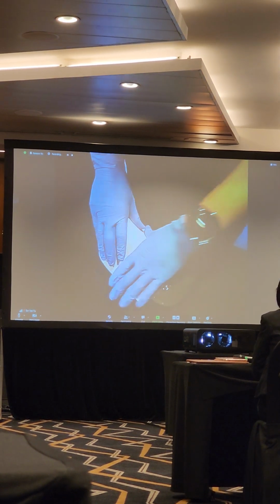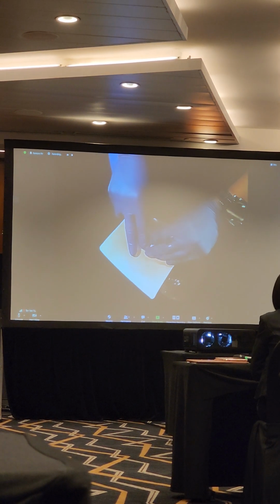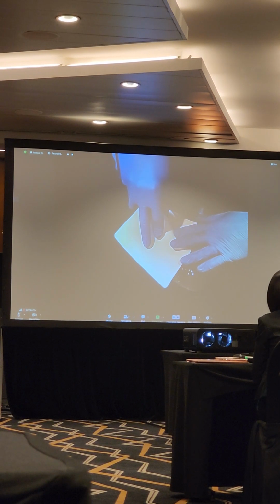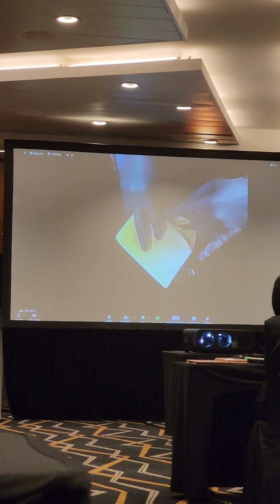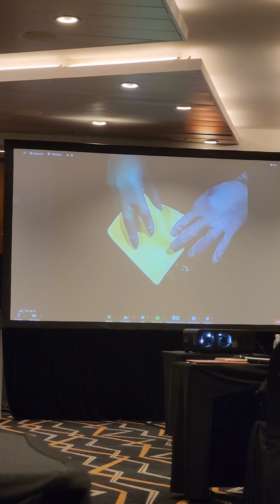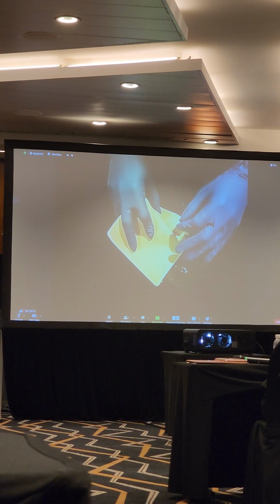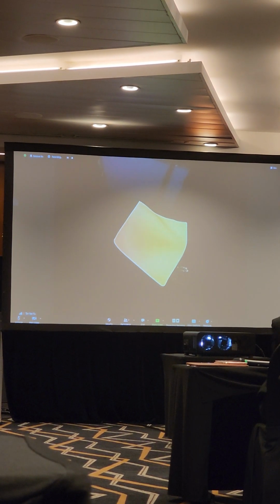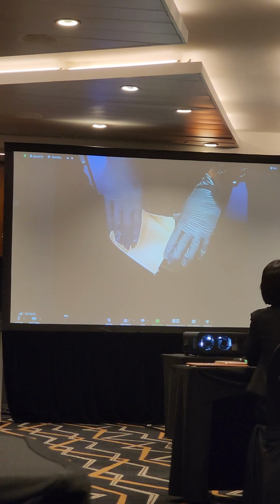What this does is mask the underlying anatomy a little bit more, so that when you feel initially, you can start to feel the underlying structures but cannot convincingly feel the anatomy. What you will then have to do is create a longer incision over the anterior part of the neck. So carrying on that vertical incision, you would then palpate the landmarks after the incision, before puncturing and doing the horizontal incision that Sean has so nicely demonstrated. This is one example of how we can alter these various models.